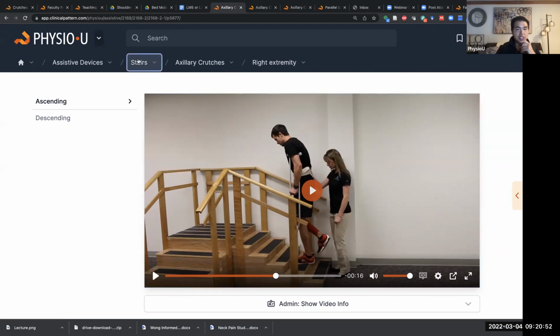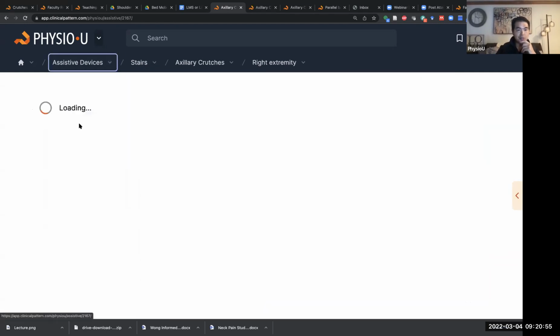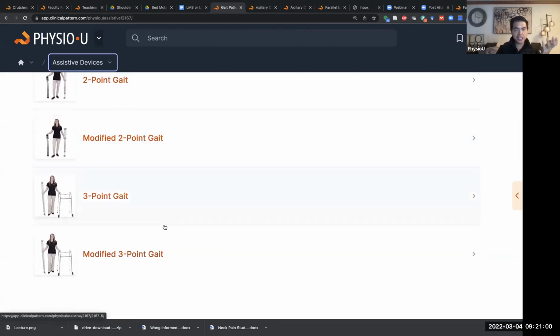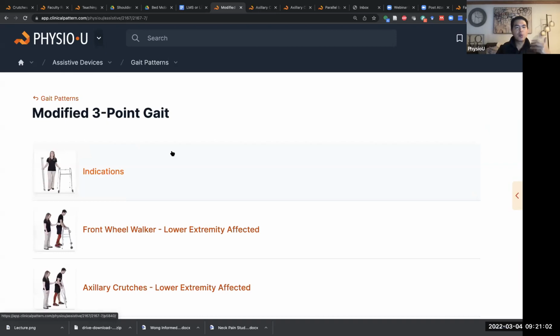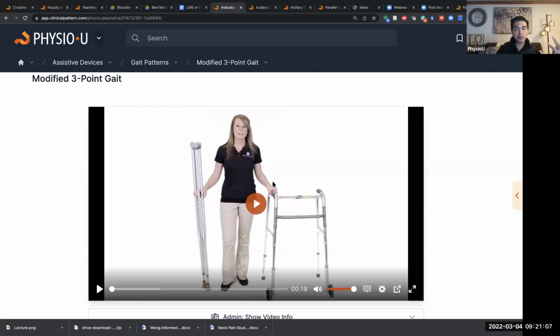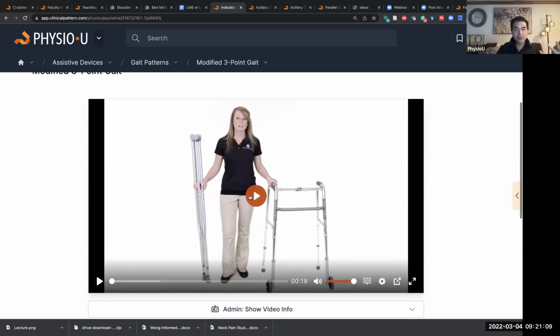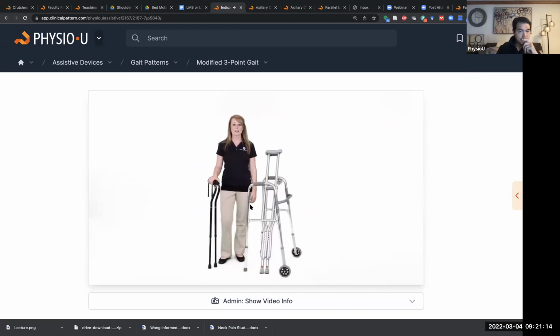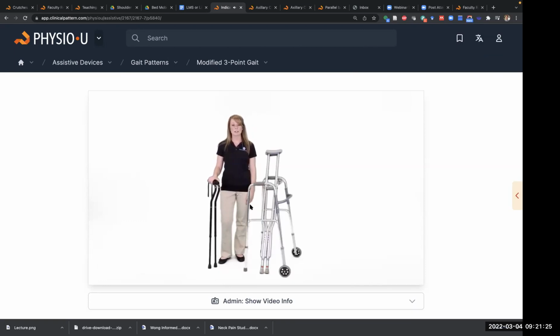So, if I segue actually back to gait patterns for a second, I remember talking with Grace about how challenging it is for a student to read about what a modified 3-point gait is, what is it for? So we have a little short explainer video, 18 seconds. For a patient that has one leg affected and the other leg is full weight bearing, modified 3-point gait can be used using either a walker or crutches. For a patient that has no weight bearing restrictions, bilateral canes can be used.